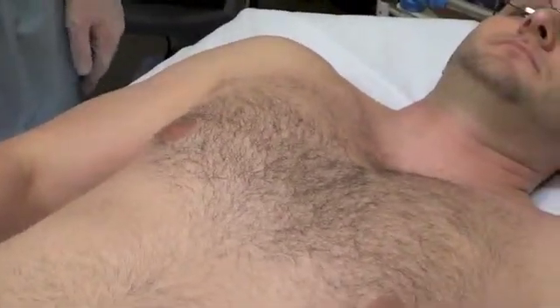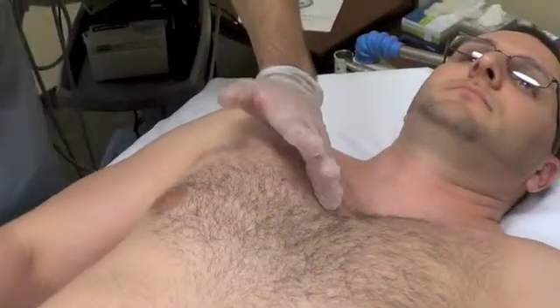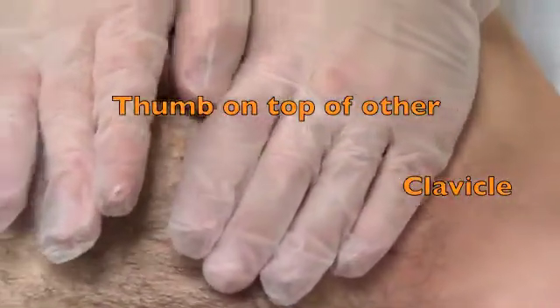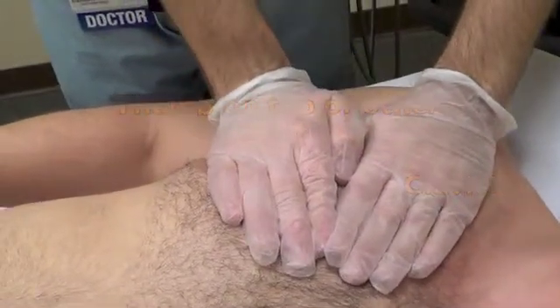For the anterior zones, we find two points which we call the upper and the lower blue points. Using our hands, we line up our pinky finger with the clavicle, and then we overlap our right thumb, our right hand over the thumbs to cover the patient's chest.